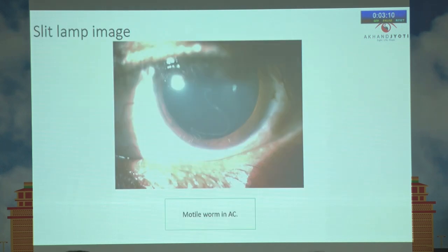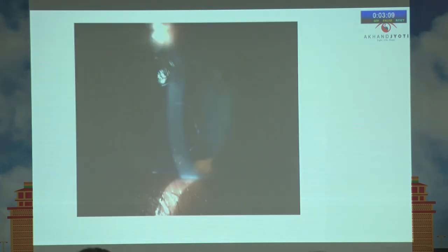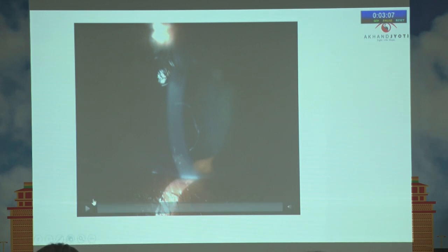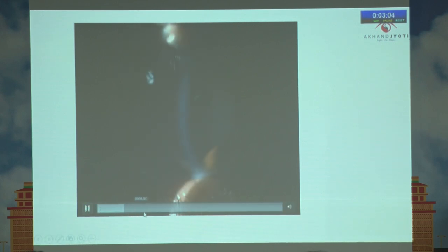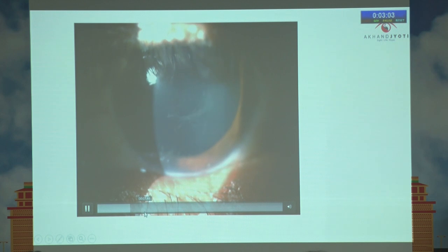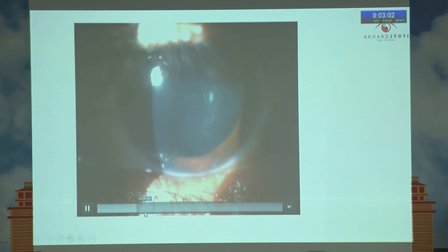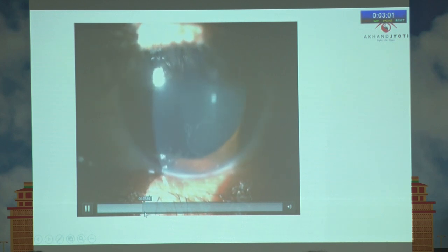This is the motile worm in the anterior chamber. Here is a video showing how it was moving when I was capturing it — this is the motile worm.